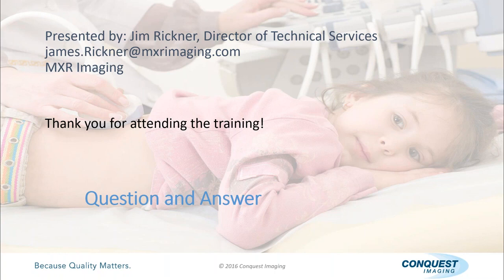So lots of reasons I like the Phantom. Again, we don't all have the same ones, I know. If you're doing 3D, 4D testing, you should get a 3D, 4D Phantom. They have those out there to evaluate that. Any other questions?